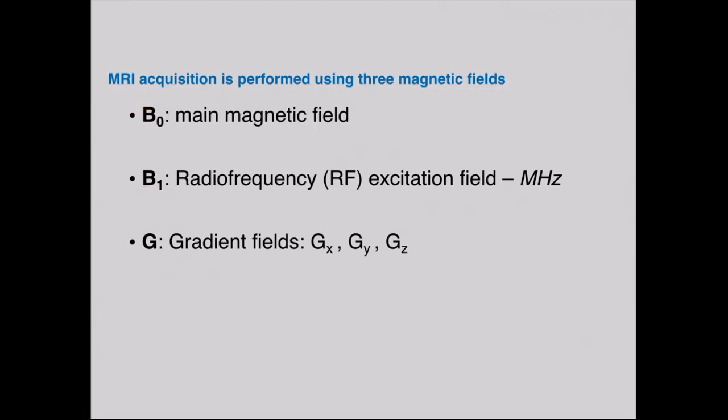The B1 field, right, like you just increment this 0 into a 1, and then that turns into an RF. So this is the radio frequency field. It's called B1. And that creates the RF excitation that we talked about, that perturbs the magnetization into the transverse plane, perturbs that system, and in return, that system will emit a signal back and relax back into its original position.